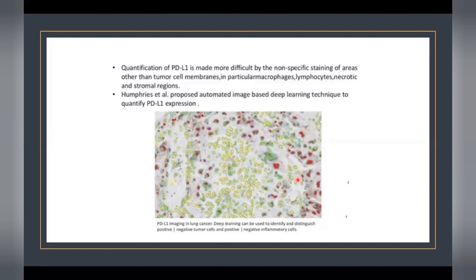So for IHC, you name Ki67, those algorithms were the first ones to come in. ER/PR, HER2/neu scoring, all these are available nowadays. They come bundled up with multiple digital scanners, and you just have to ask them, we want ER/PR/Ki67 reporting, and they will give it to you. Of course, they will charge you for that. And you run your slides through it and you get an accurate score coming out of it.